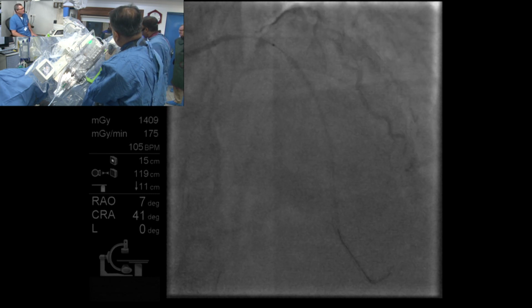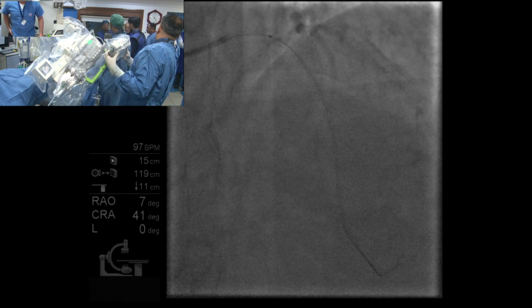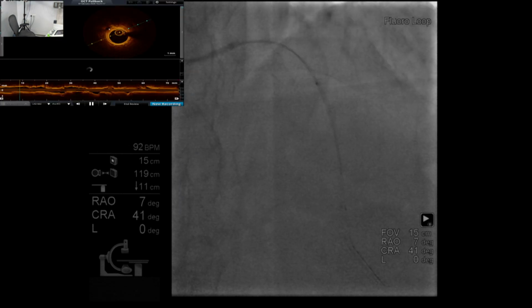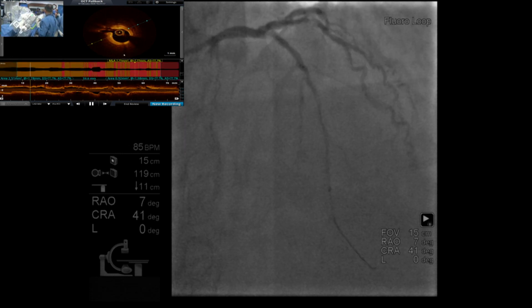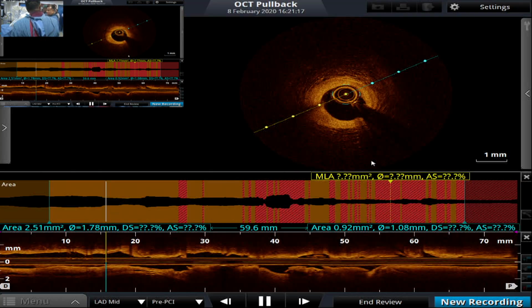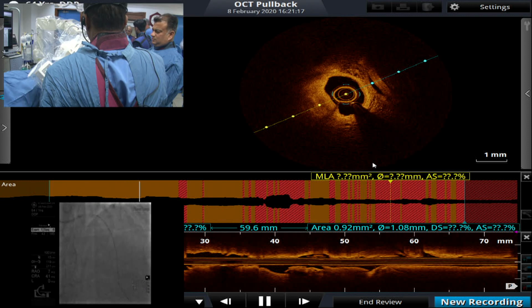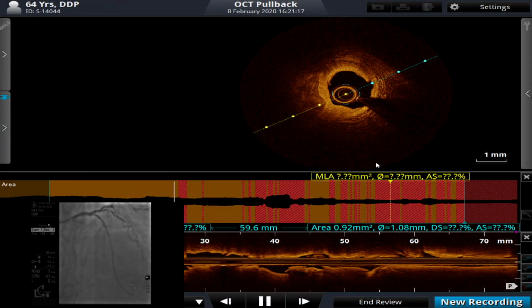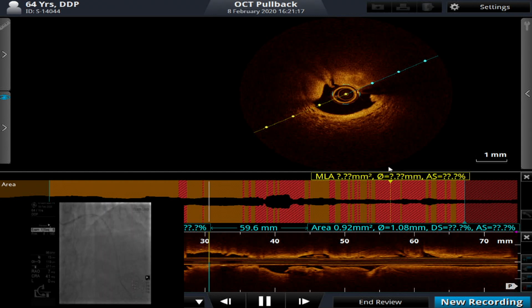Beautiful. Stay off fluoro for me, would you? It's a good fibrosis and otherwise normal. This is the fibrous area. And what's the size distally? Actually, 2.0. Frankly speaking, yeah, 2.0 lumen. And it's a good landing zone you are going to get for sure. See, this is calcium, but it's patchy. Yeah. You're going to have to give me permission to put in a 2.5 stent.